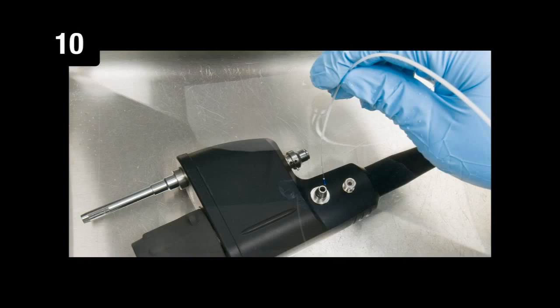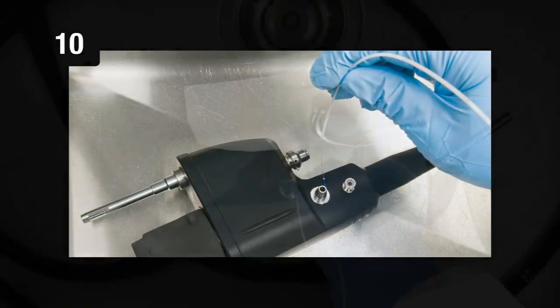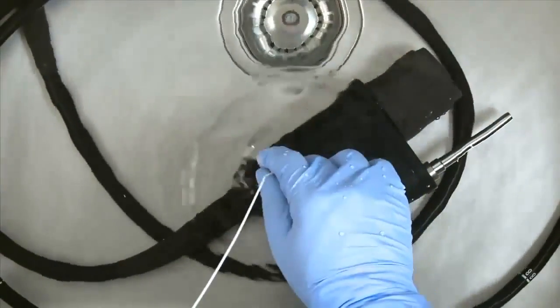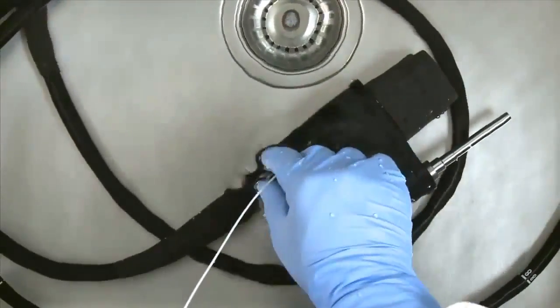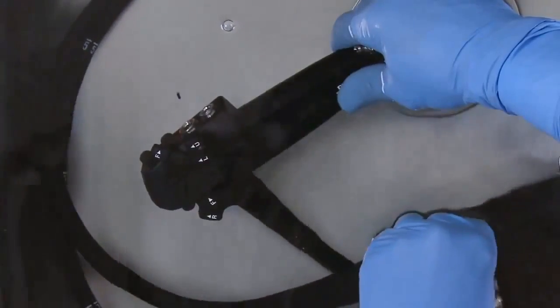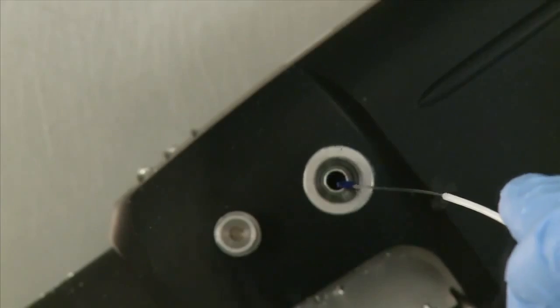Step 10. Brush the endoscope's channels. Using the long disposable channel cleaning brush, brush the suction port from the PVE connector at least 2 times or until the bristles emerge from the suction channel cylinder visibly clean. Ensure that the blue tip is inserted first.